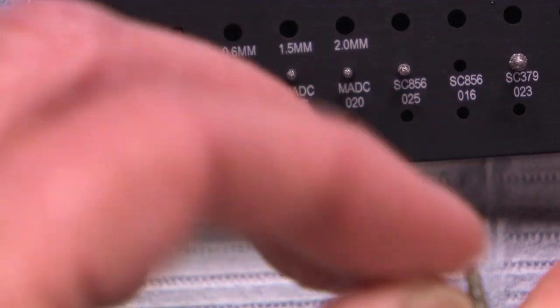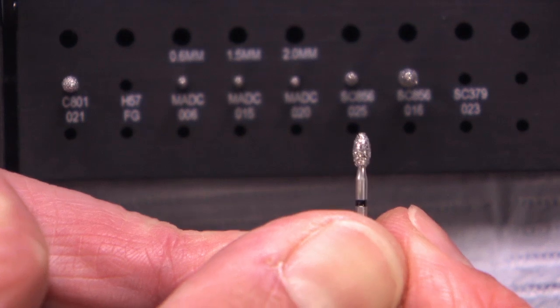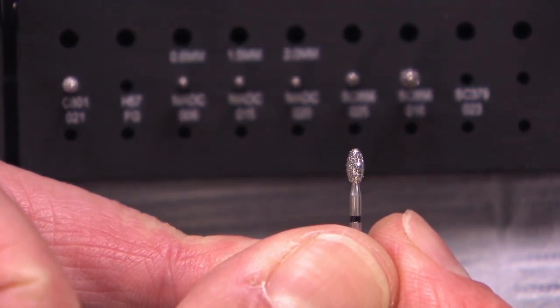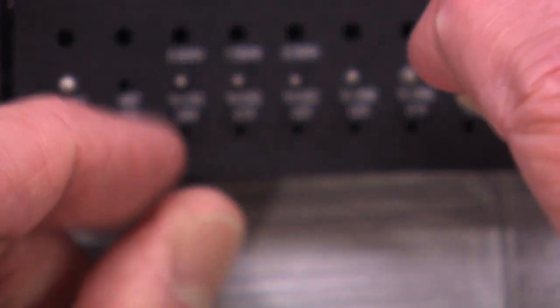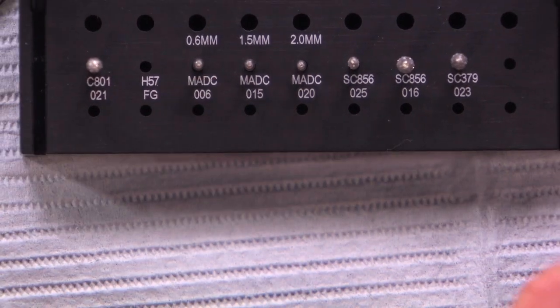And then for lingual reduction on anterior teeth, or you could even use this on posterior teeth for occlusal reduction, there's our supercoarse 379023 football burr, and of course, because of its convex shape, it's going to give us a concave depth cut or reduction on the lingual of those anterior teeth. And that's it. There's a couple other burrs that I use that I just want to bring in.